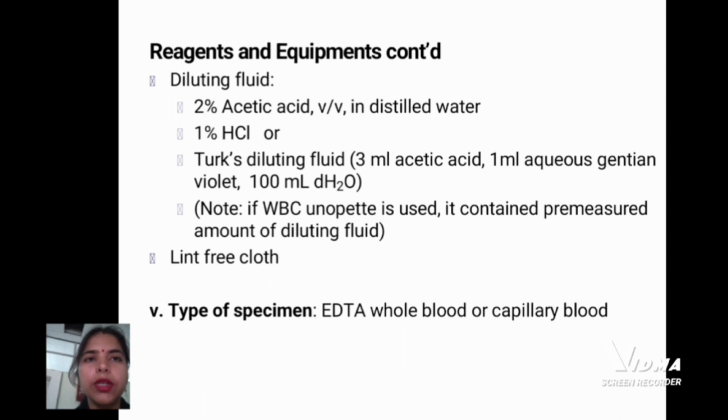Next, the diluting fluid: 2% acetic acid, distilled water, 1% HCl, Turk diluting fluid, and WBC diluting fluid, lint free cloth. Type of specimen, that is the EDTA whole blood or capillary blood.